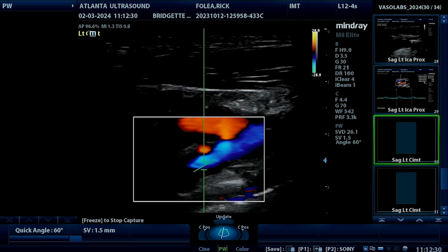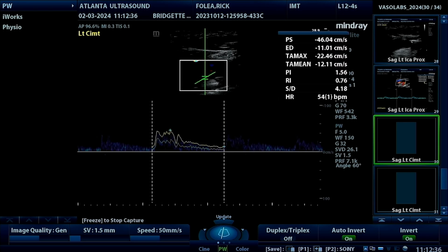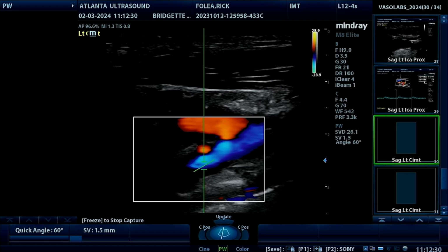It carries blood down to the thyroid, upper larynx, stuff like that. This flow highlights the bifurcation where the common carotid artery splits into the internal and external arteries. Do another audio test, and sure enough, we see the jagged waveform which tells us it is in fact the external carotid artery. And we still see the aortic valve closing solidly. So we've now confirmed the external carotid artery is the bottom branch, which again is unusual because the external carotid artery is normally on top.